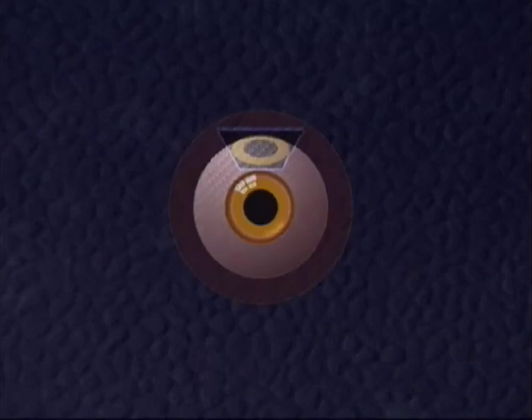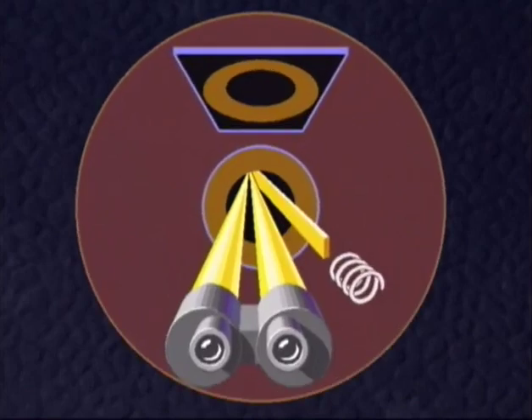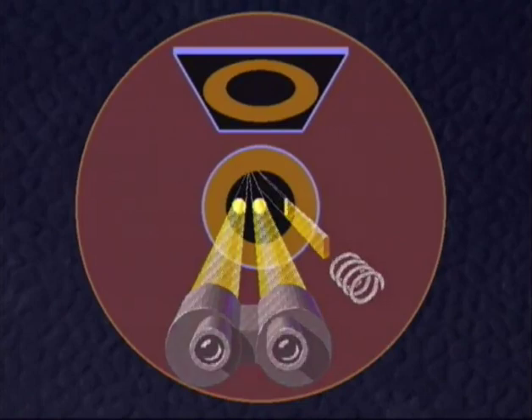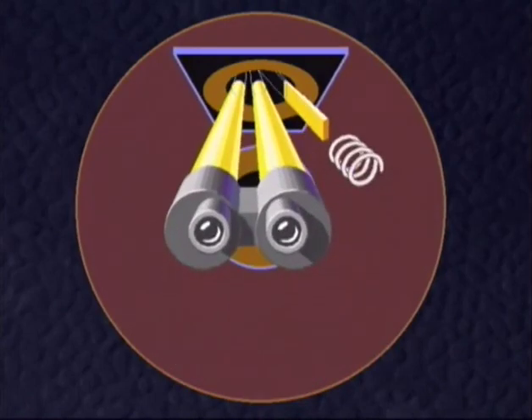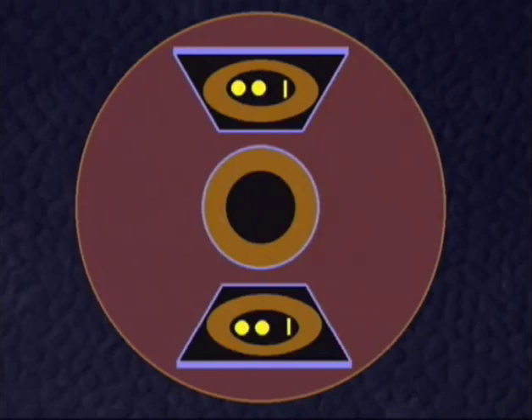When seen through a contact glass mirror, the pupil appears as an oval and the horizontal diameter becomes smaller in some positions. As we remember, two bundles of observation rays leading to the microscope, as well as the bundle of the illuminating light, must pass through the pupil for a binocular view of the posterior segment. When observing through mirrors, only at the positions of 12 and 6 o'clock is the horizontal diameter of the deformed pupil large enough to permit the passage of all three bundles.